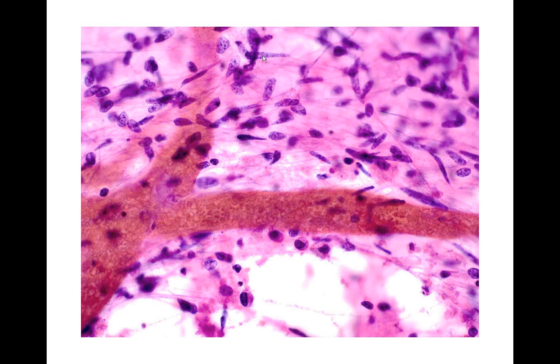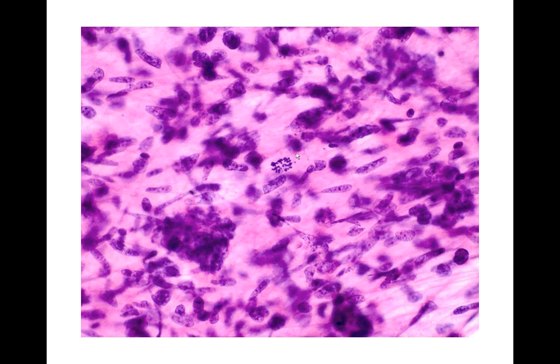And the tumor cells themselves look really wild and atypical. There's a lot of variation from cell to cell. They're bad-looking, nasty things. And in other parts we actually saw this mitosis. This is a mitotic figure. This is a tumor cell that's caught in the act of cell division. It's producing two daughter cells.